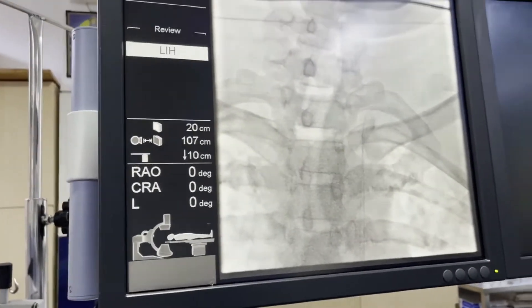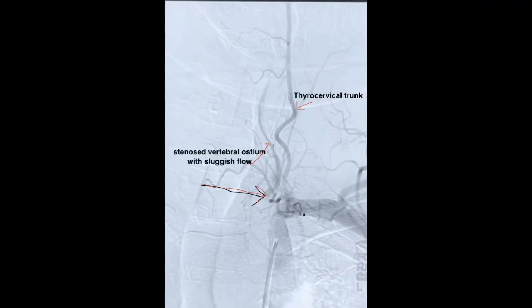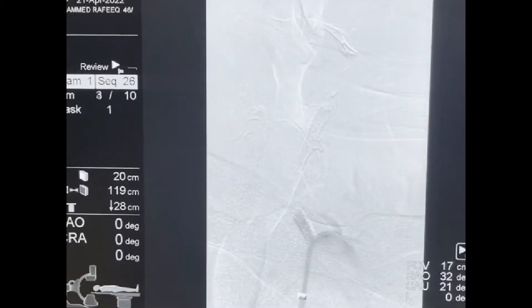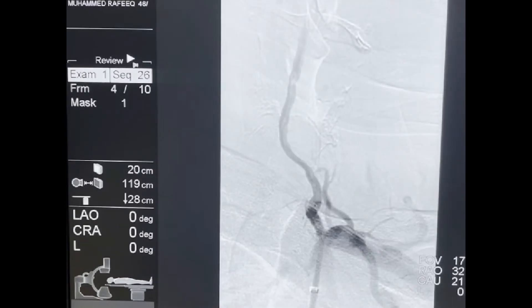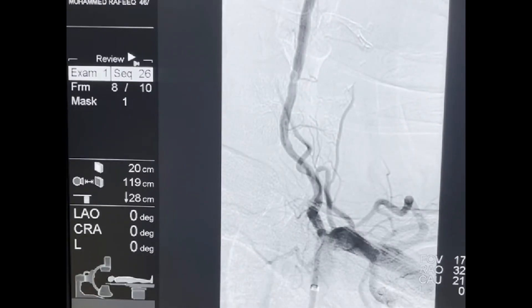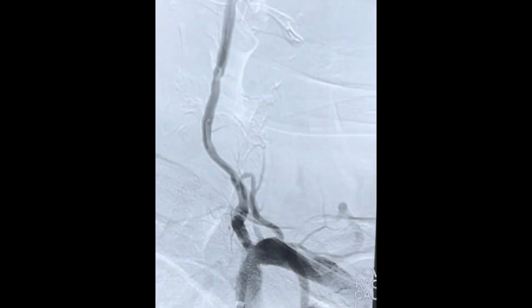We can now safely pass the catheter. This femoral artery catheterization was done by Dr. Arun, our first-year DM Neurology resident, prior to a vertebral artery stenting for a stenosis. The post-procedure image shows the stent placed to restore flow to the vertebral artery. I thank all my teachers at MES Medical College — Dr. Fasal Gafoor, Dr. Mohammad Rafik, and Dr. Feroz Khan — for teaching me these interventional techniques. I hope you enjoyed the video. Thank you.